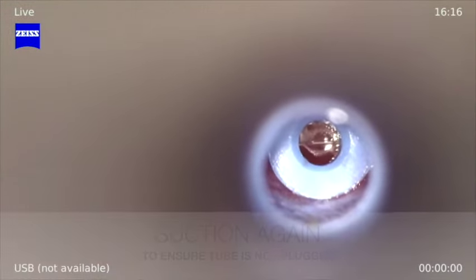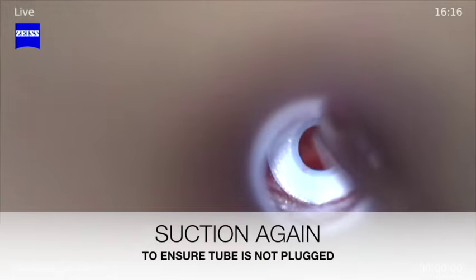Once the tube is in place, the suction is used to ensure that all the fluid is removed from behind the eardrum.